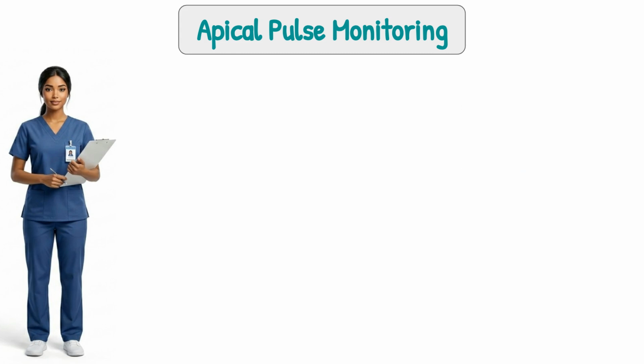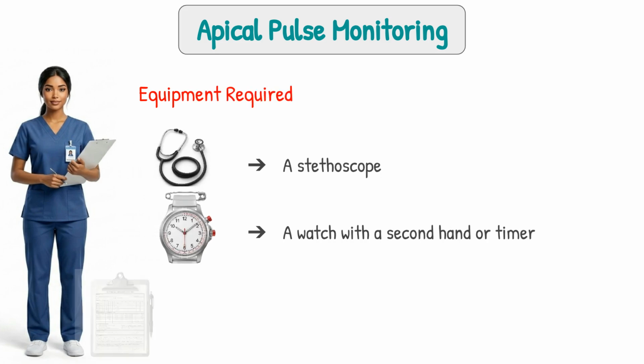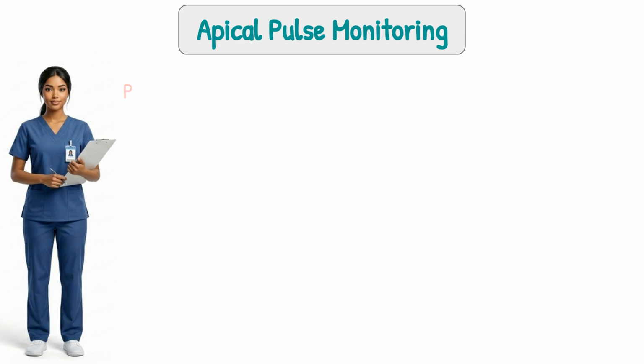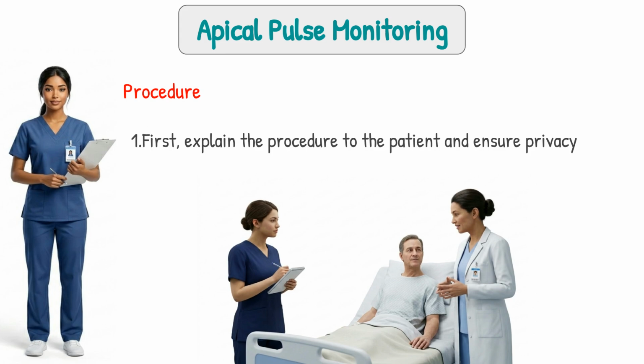For this procedure, we need a stethoscope, a watch with a second hand or timer, and a documentation sheet or nursing chart. Always ensure the stethoscope is clean before and after use. How to do it. First, explain the procedure to the patient and ensure privacy.